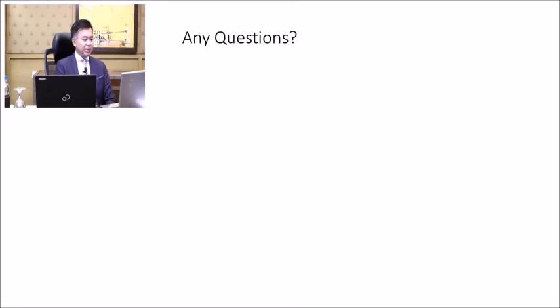What is my experience with the Panoptix? Yes, I have used the Panoptix. I get this question about superiority. You're asking me, is the Panoptix superior to the Symphony or vice versa? It's not a question of superiority. It's a question of whether you're looking at quality of vision at a continuous range, or discrete levels of good vision at three main points in a trifocal, with the association of potentially more glare and halos. And that's something that you have to decide, which is your best choice for each particular patient after discussing that with them.